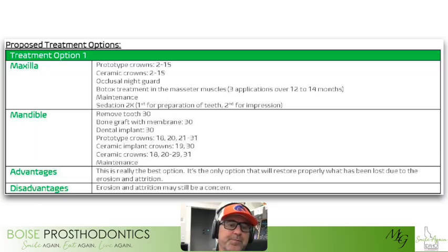dental implant. And so in the end, he should have the result of ceramic crowns replacing the damaged and lost tooth structure with new prosthetic material at the proper occlusal vertical dimension with the proper articulation of the teeth. And that's the ultimate goal. That will provide him with the most successful and comfortable and functional result if we can achieve that successfully.